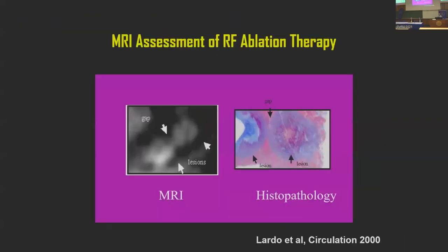Now, it's interesting if you look back, it's now been 25 years since the first studies showed that you could actually see these ablation lesions. And again, ultimately, I think the challenge right now is, as I noted in the previous talk, when they do the ablations, they basically put a little red dot there and they say, okay, I've ablated that area, but they have no idea how much tissue they've actually ablated. But MR can tell them. And if we can tell them that they've really covered that area and that they've created durable lesions, then we believe that that will predict better outcomes.